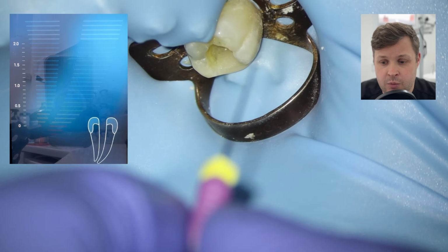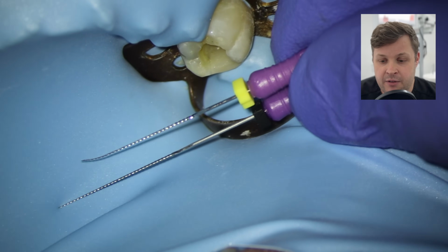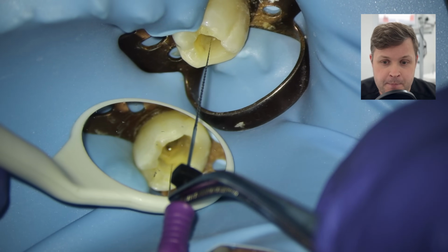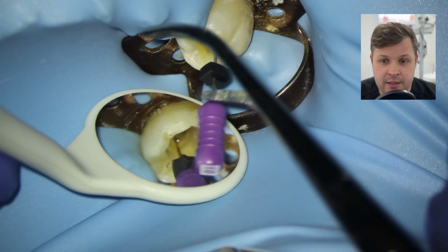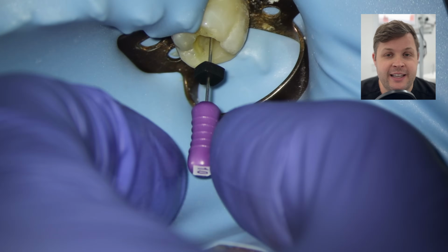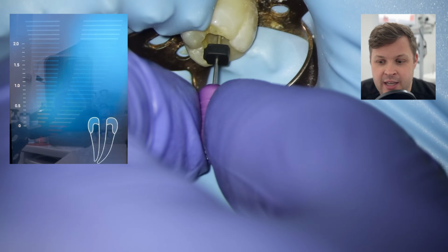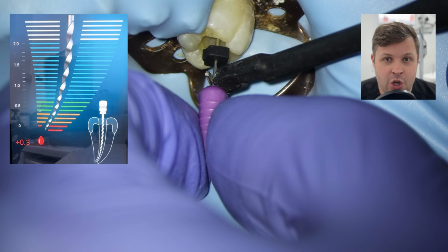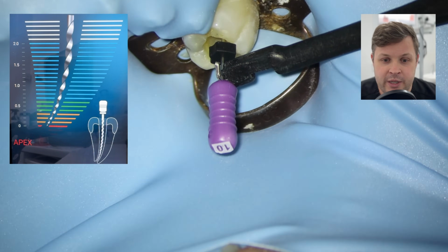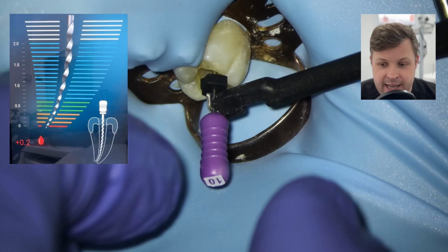So in this case, I'm going to use a larger length K file. So I'm going to use a size 31. This gives me a little bit more shank on the K file for us to negotiate to the working length, but also gives me a little bit of space for me to clip the apex locator on this tooth. And again, as we negotiate this length 31K file down, we connect up the apex locator, and straight away we're through the apex.